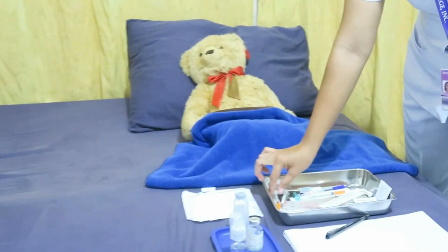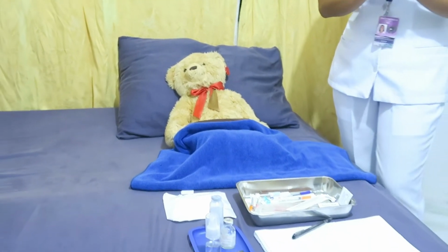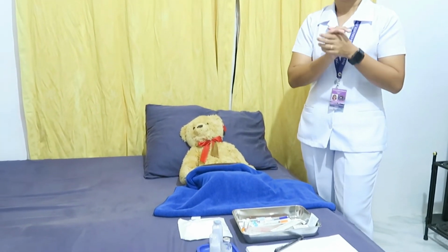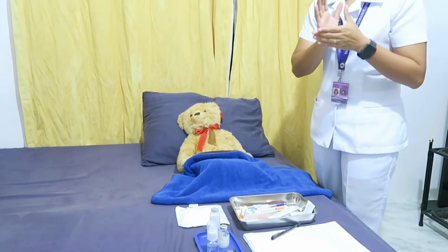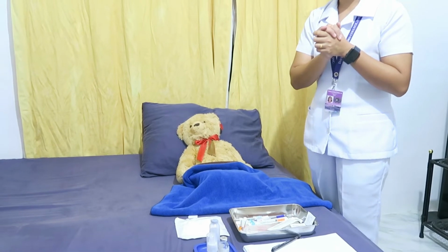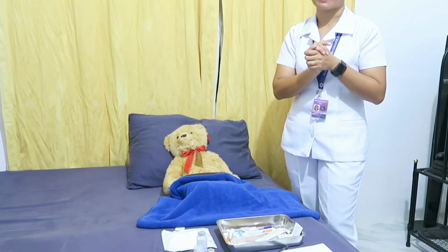Then discard. And after that, if bleeding occurs, apply pressure to the site with dry sterile gauze until it stops. The rationale for that is that massaging the area may interfere with test results by spreading the medication to subcutaneous tissue. Then let's proceed to the next procedure.